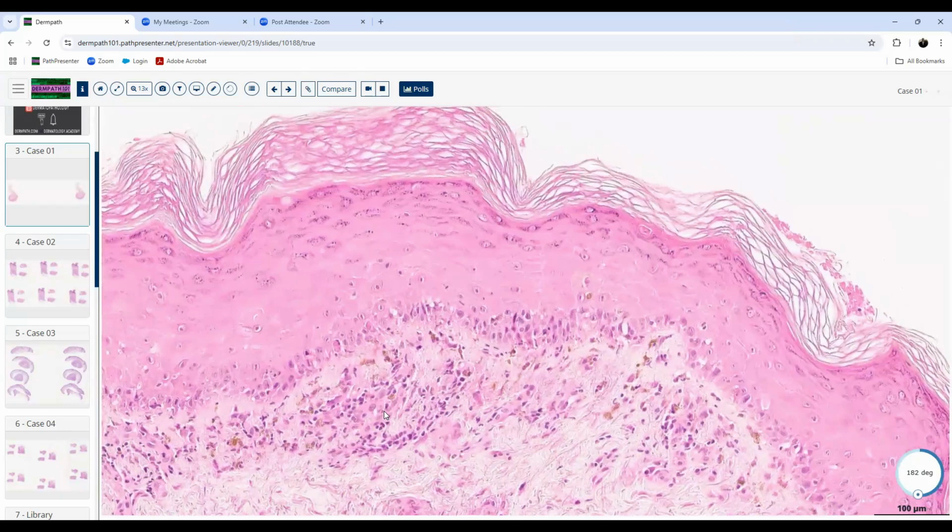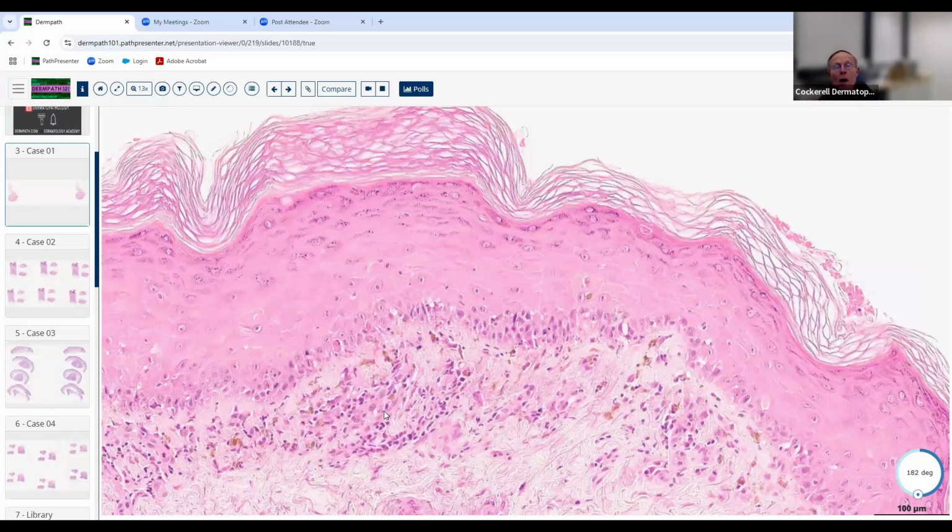What's not good about it is, let's see. I didn't really see any eosinophils. I know you don't always have to have EOs. I guess there is some spongiosis there. Yeah, you often do see spongiosis in relatively early erythema multiforme.